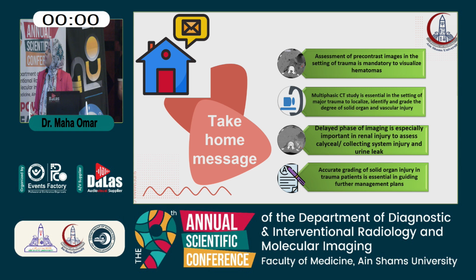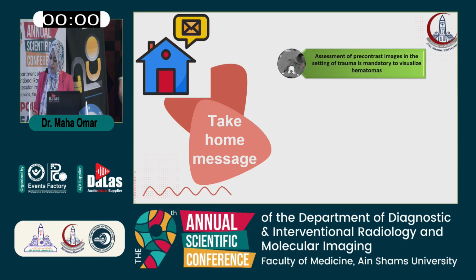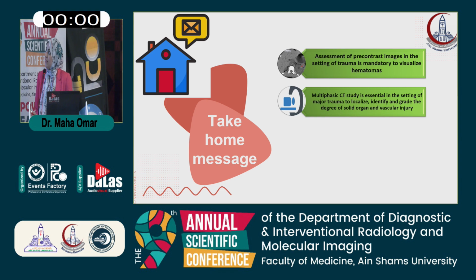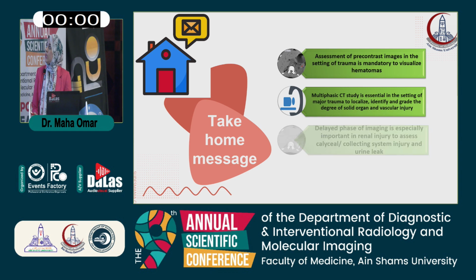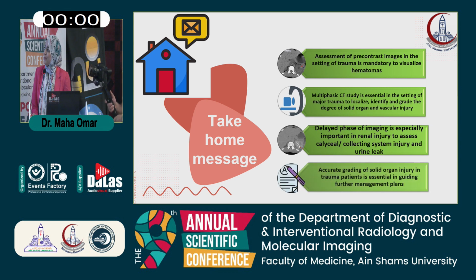So our take-home message: assessment of images in the setting of trauma is mandatory to visualize hematomas. Multiphasic CT studies are essential in the setting of major trauma to localize, identify, and grade the degree of solid organ and vascular injury. Delayed phase imaging is especially important in renal injury to assess calyceal or collecting system injury and urine leak, which change the grade of injury. Accurate grading of solid organ injury in trauma patients is essential in guiding further management plans.